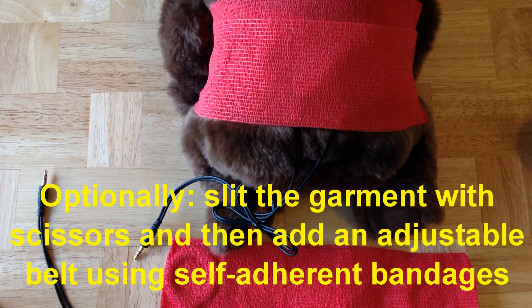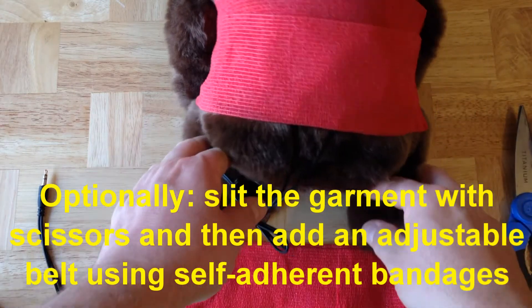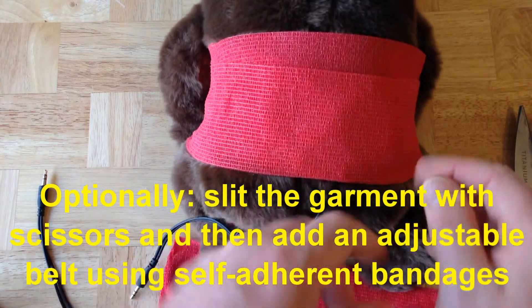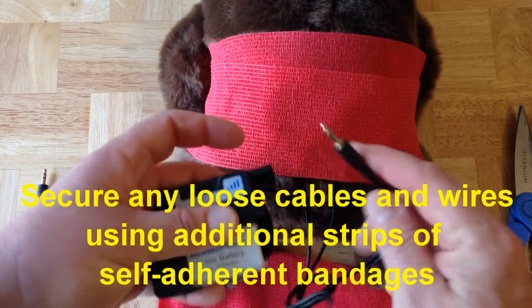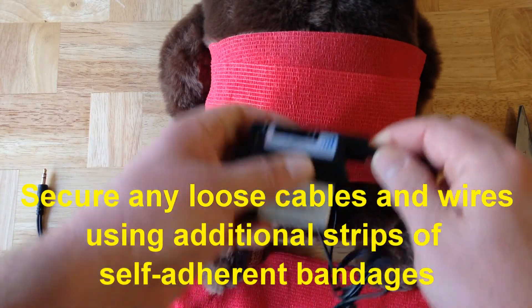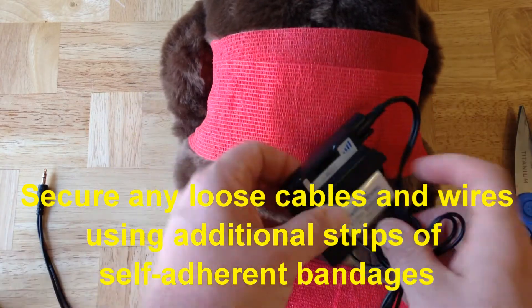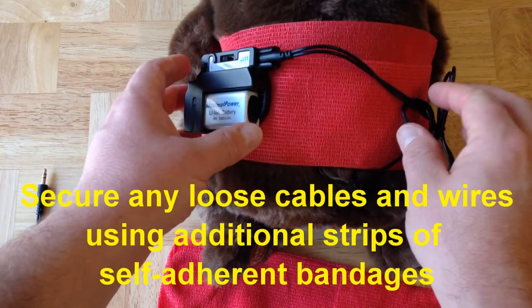For example, you can use scissors to slice across the garment and create an opening. You can then add additional strips of the self-adhering wrap to make an adjustable belt closure. You can also add strips to hold the pulse generator and the cable wires in place. In this case, I may wish to place the pulse generator off to one side and the cable wires off to the other side.